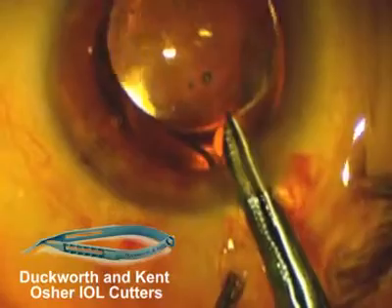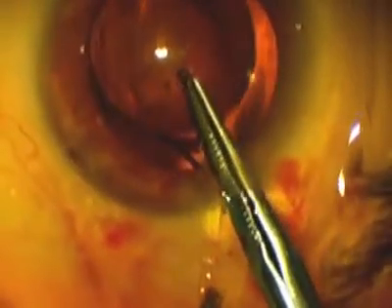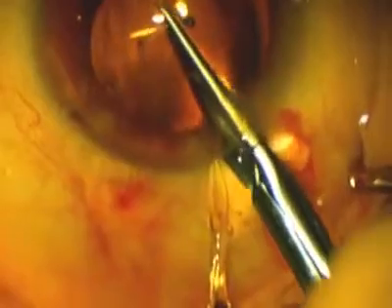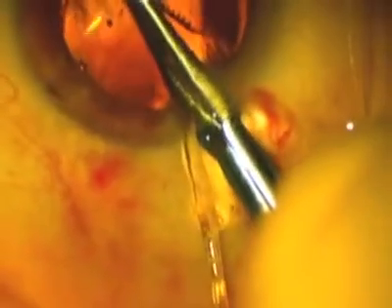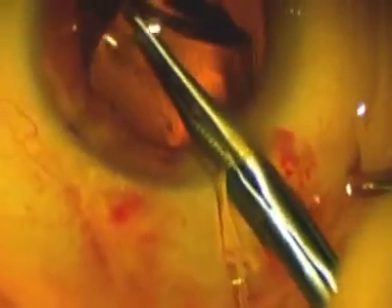I used some Duckworth and Kent Osher IOL cutters, which are nice because they're a little bit serrated and they easily cut through these lenses. I held the lens with one of the externalized haptics and I cut it almost all the way across, just leaving a little bit attached still so that that part would come out as I brought the first half out of the eye.